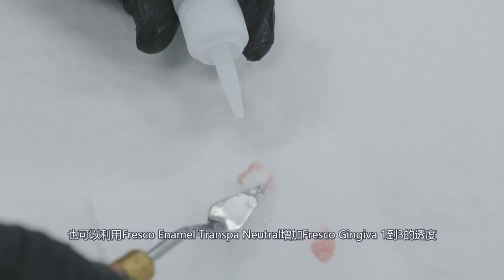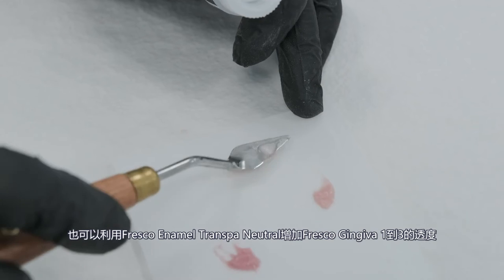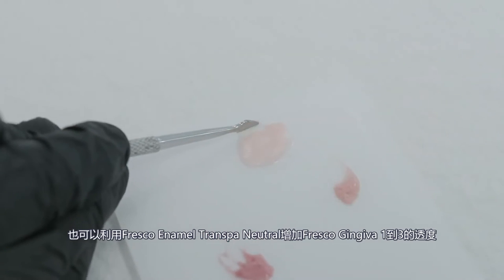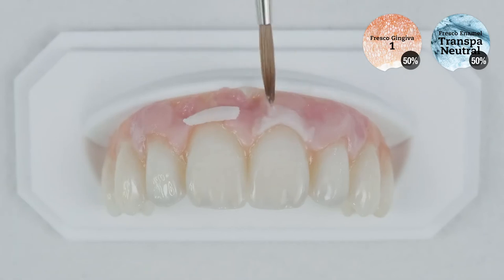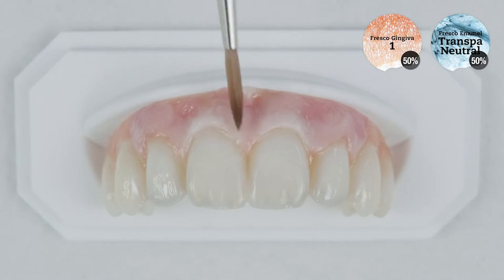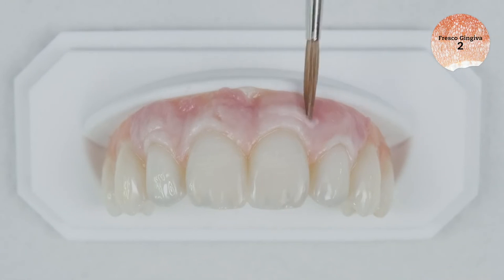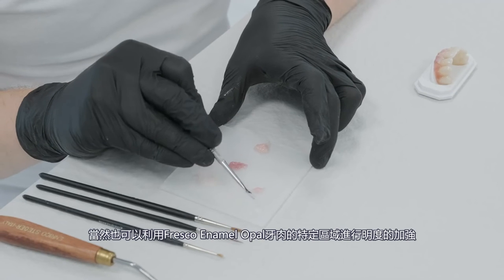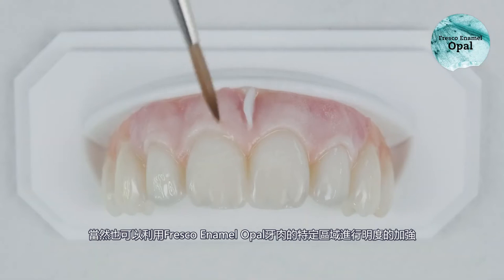The translucency of the light-colored Fresco Gingiva pastes 1 through 3 can also be increased by adding Fresco Enamel Transpa Neutral. You can use Fresco Enamel Opal to lighten specific gingival regions.